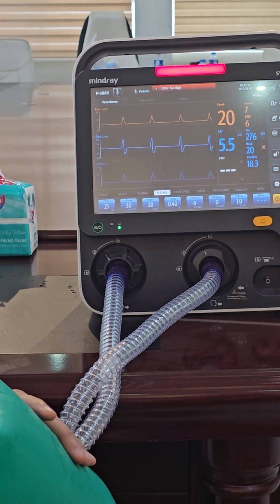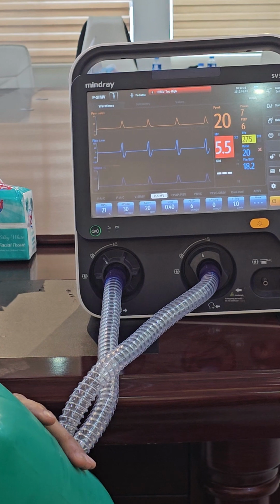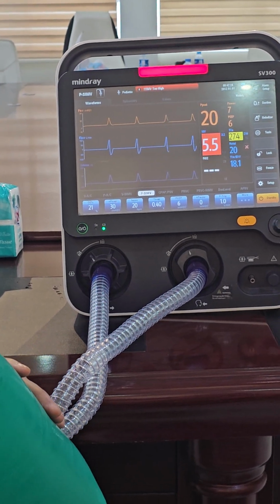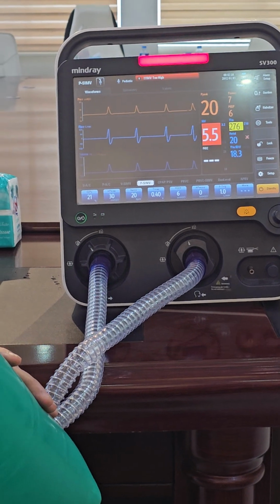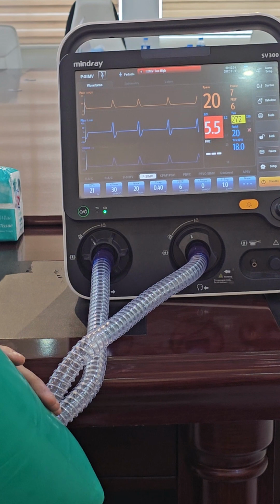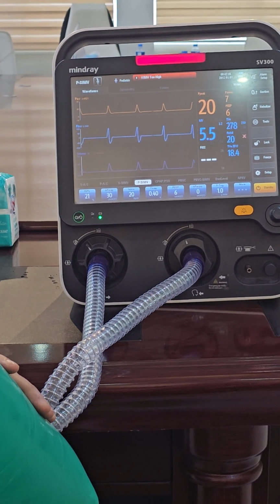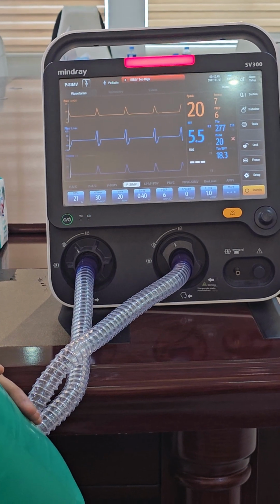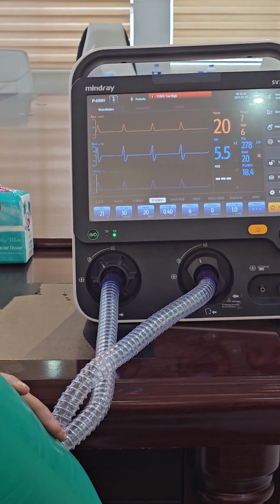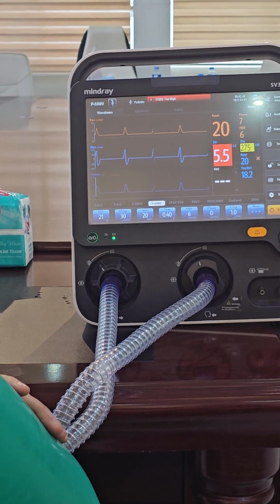But it will support only if the patient achieves 25% of the previous cycle. Otherwise, the second one will not be supported. Yes. That's called PSV, which means the baby will drive the machine. You understand? But what is the problem with that? Let's say you have a driver, and the driver is drunk. Will he be able to drive? No, exactly. So when you give sedation, we cannot give PSV.